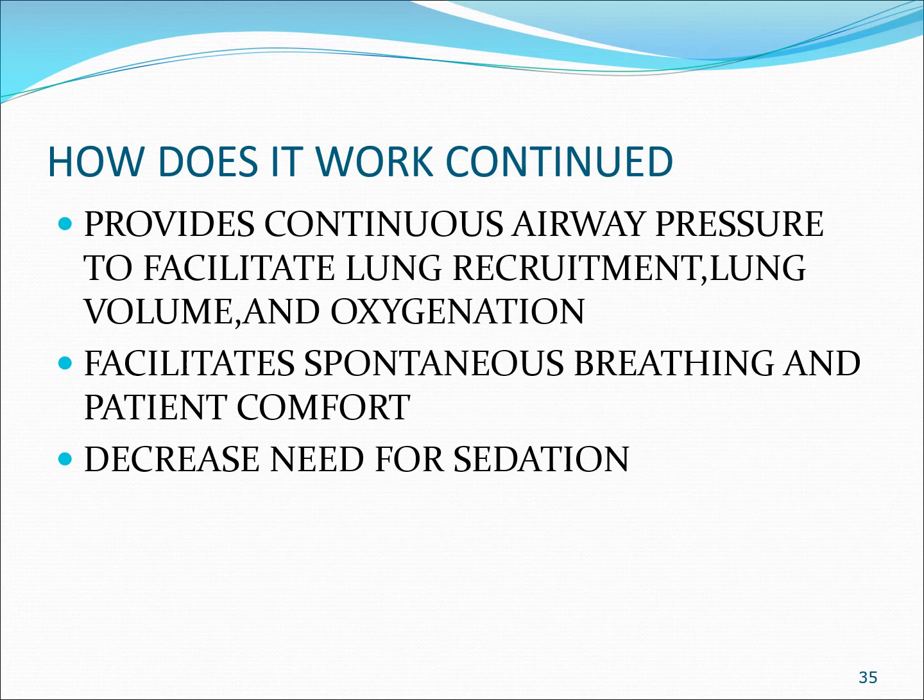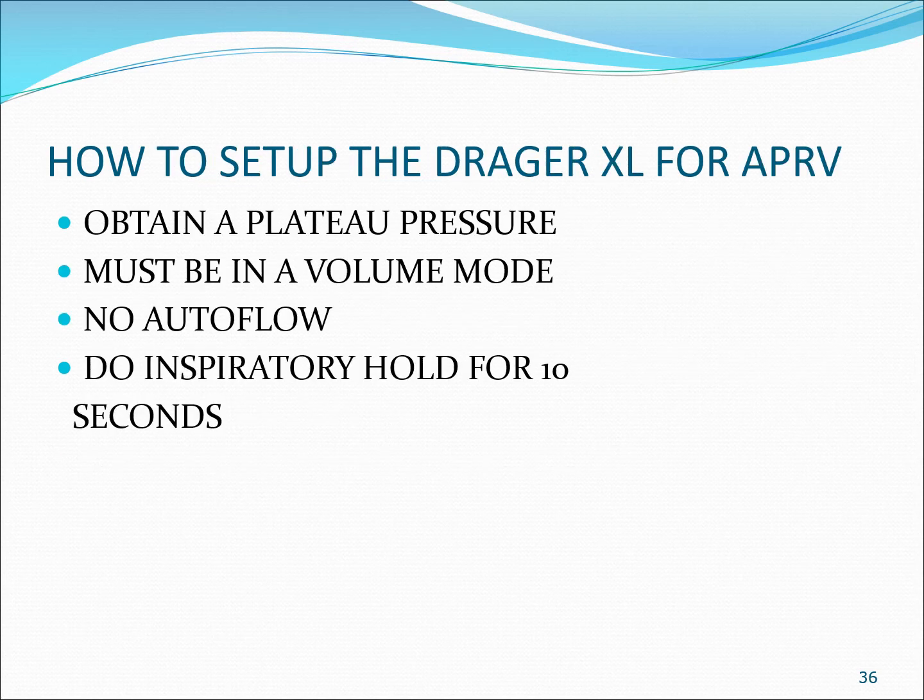So some of the advantages: it provides a continuous airway pressure to facilitate lung recruitment, lung volume, and oxygenation, because it gives you more time to recruit collapsed alveoli. It improves oxygenation, it facilitates spontaneous breathing, and it decreases the need for sedation. So all of these factors make APRV very attractive. Now I'm going to teach you how to set up APRV.